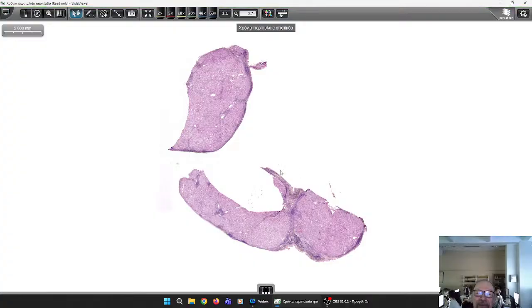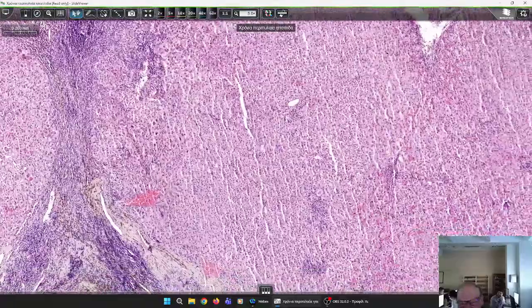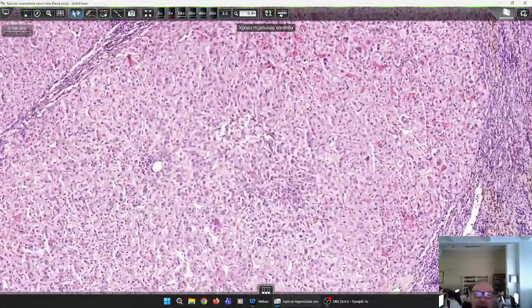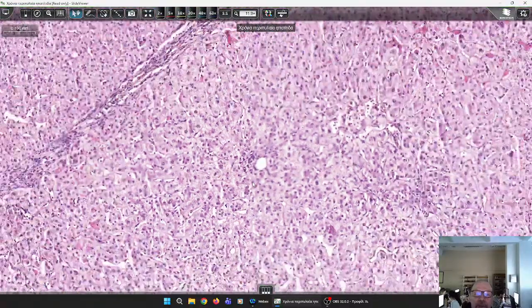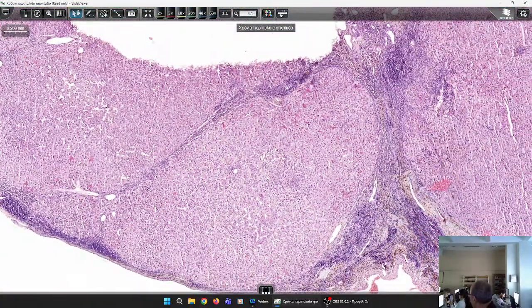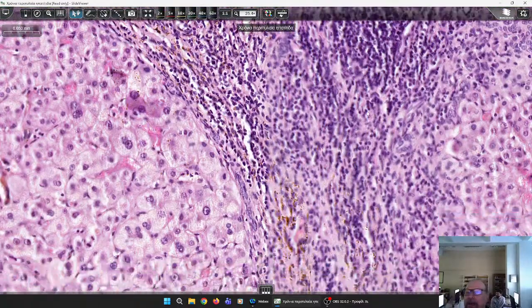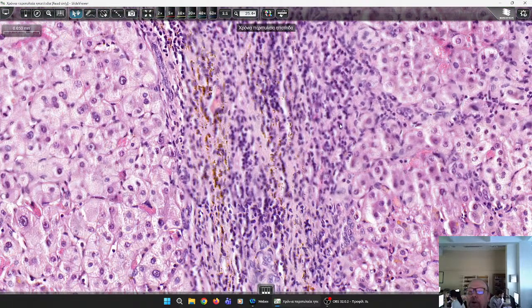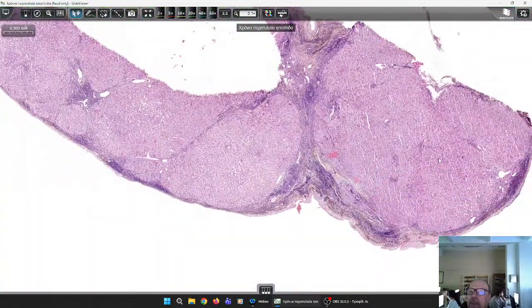So have a look at this liver biopsy and please try to identify, this is most probably a central vein, perhaps, in the center of the lobule. But I want to find a portal tract, because you see all these septa with inflammation. This is indication of an activity in the hepatitis. And you see also periportal hepatitis. You see the immune cells passing through zone 1 of the liver, the hepatic lobules.